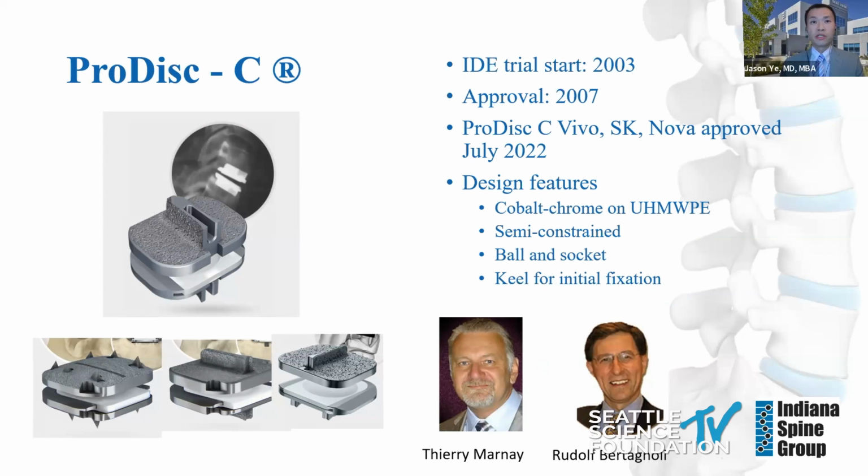The ProDisc-C was introduced in Europe and then brought to the United States starting in 2003 when trials started. It has a ball and socket articulation, cobalt chrome on ultra-high molecular weight polyethylene for the bearing surface, and an ingrowth surface for fixation. These are elements that previously demonstrated success in total hip.